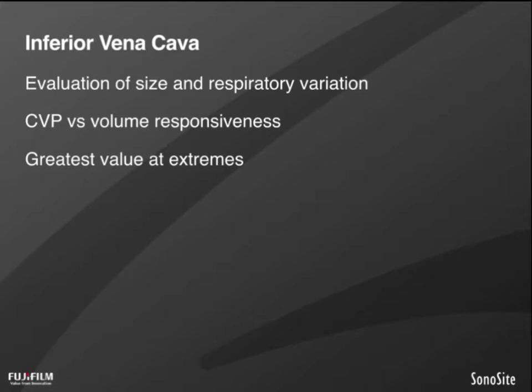And like many tests, this test has the greatest value at extremes. The majority of findings, however, are somewhere in the middle, which makes it of unclear value. And there are a great number of physiologic considerations for using the IVC appropriately, which we'll review.